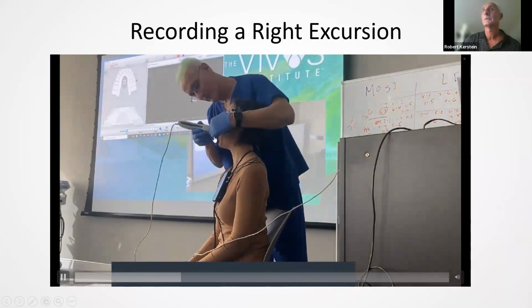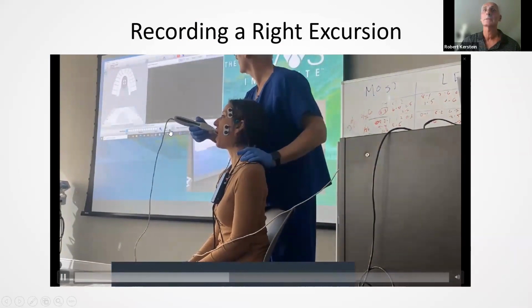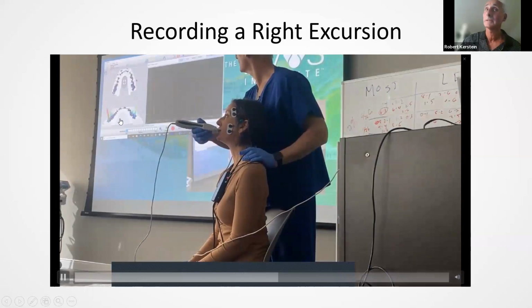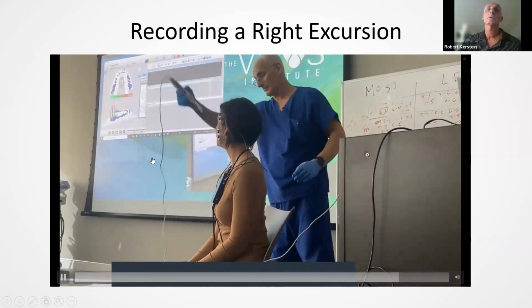I'm placing this on her teeth. Now watch how I look at the screen, and then when I look at the screen, now I'm going to hit the button on the handle. Now I give her the instructions to bite down, and I watch it, and now I tell her to go to the right. So I'm watching the whole thing, and then once it gets all the way out to the right, then I turn it off.